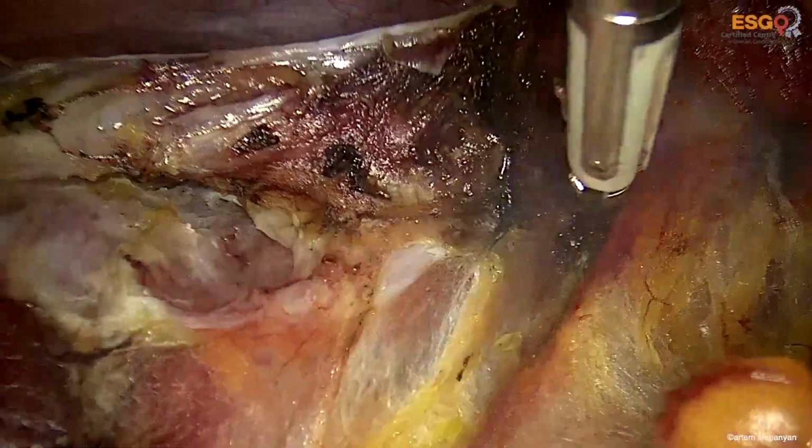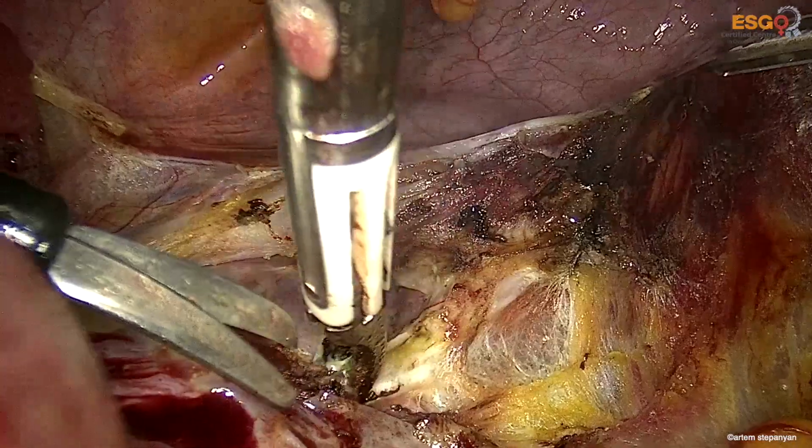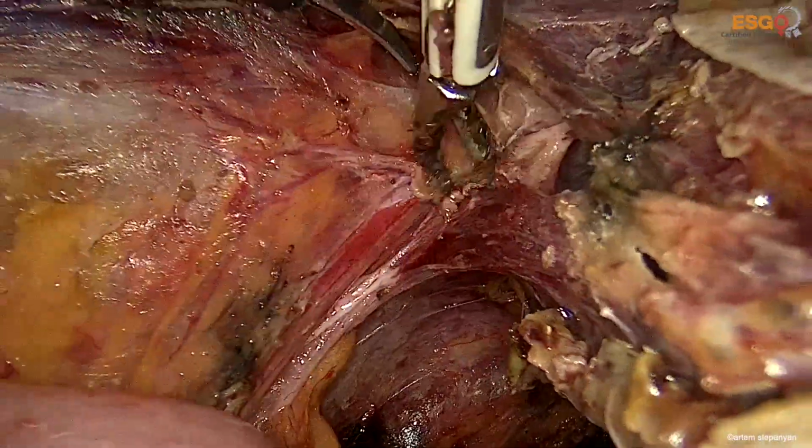And the areolar tissue located between both leaves of the broad ligament is incised. And now we're seeking for branches of the uterine artery.